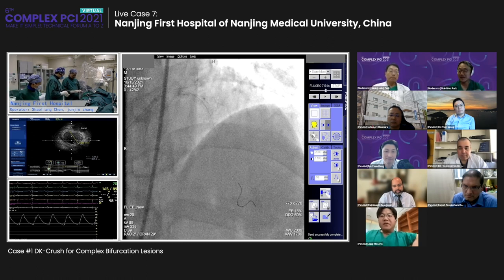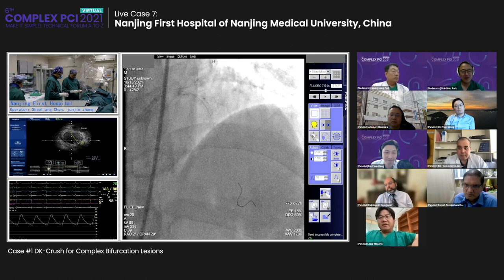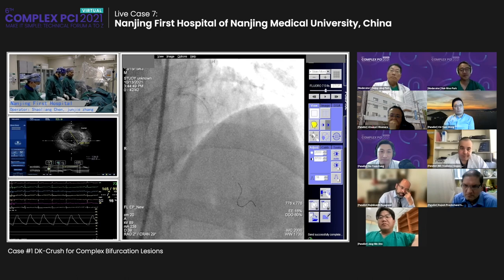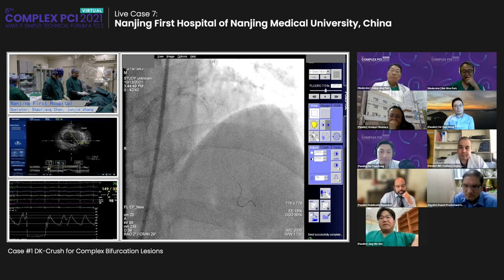Dr. Chen, this is Jung Min Han. I have one question about the first kissing, particularly in this case of heavily calcified LAD disease. When you do the first kissing, is there any risk that the carina may move to the main branches, so it makes the LAD stent delivery more difficult?